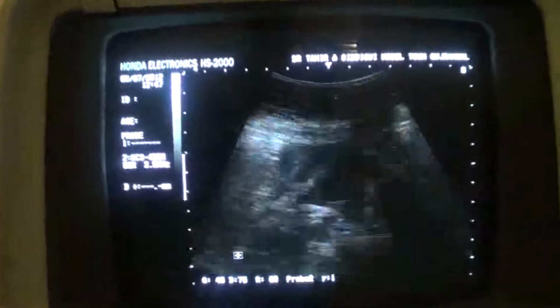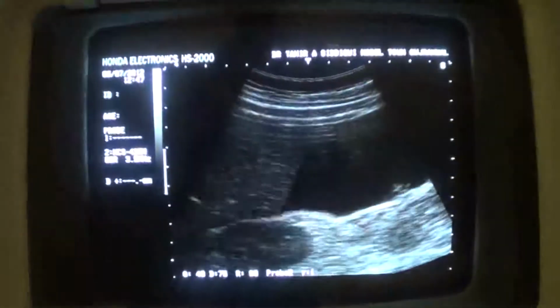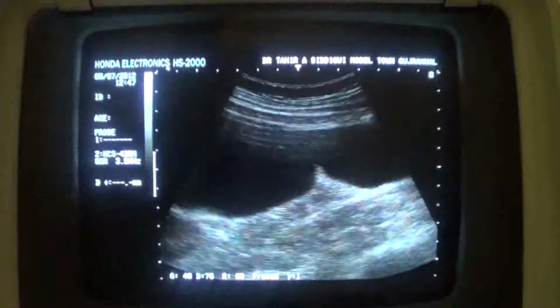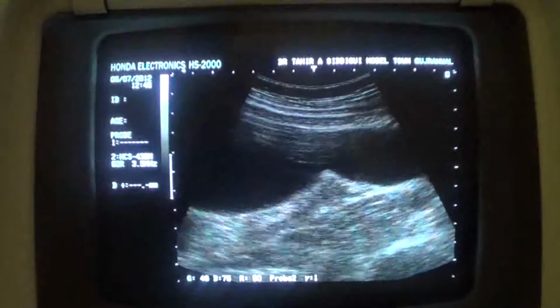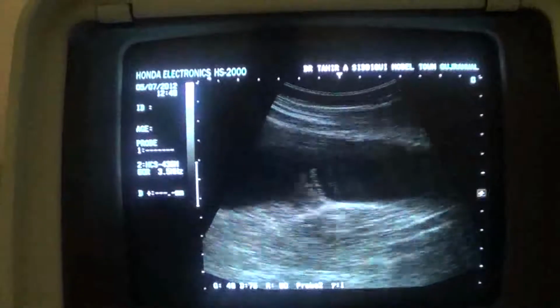And when I go to the abdominal region, on the right side, again there is fluid in the right para-colic gutter. Note the amount of fluid. This is the iliopsoas muscle. This striated, longitudinal structure is the right psoas muscle, and this is all bleed, all fluid.